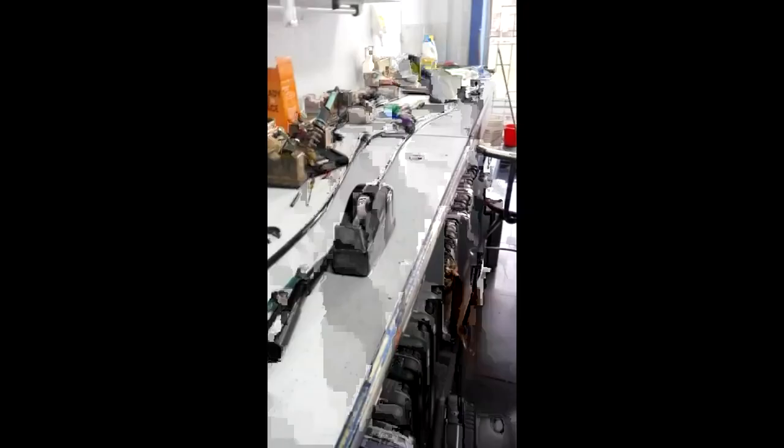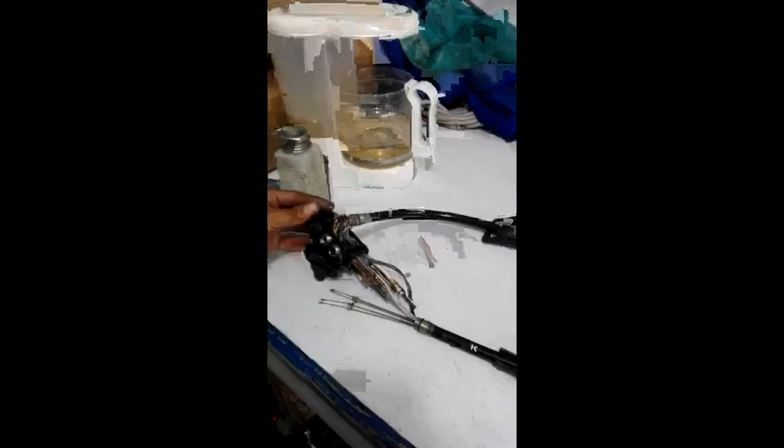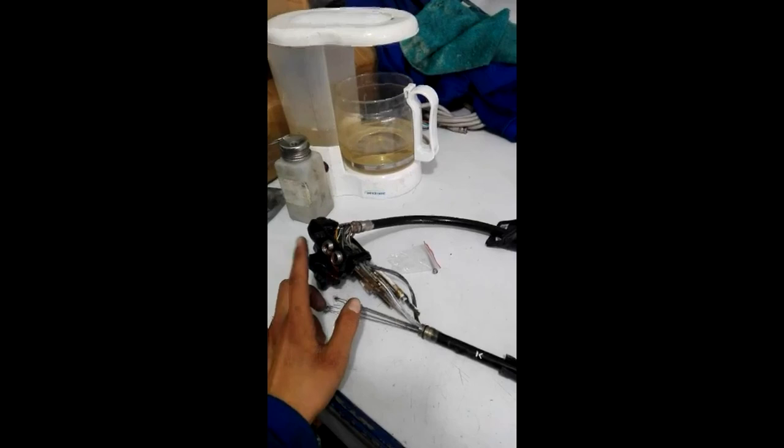Portanto, eis aqui tudo o que compõe o endoscópio ou, no caso, o cabo flexível do mesmo. O cabeçote com todas as ligações elétricas, eletrônicas, de água e de ar. Os botões de água e ar para o comando da ponta distal, e na sequência a outra extremidade do cabeçote de comando, que é conectado às fontes de energia e de luz.